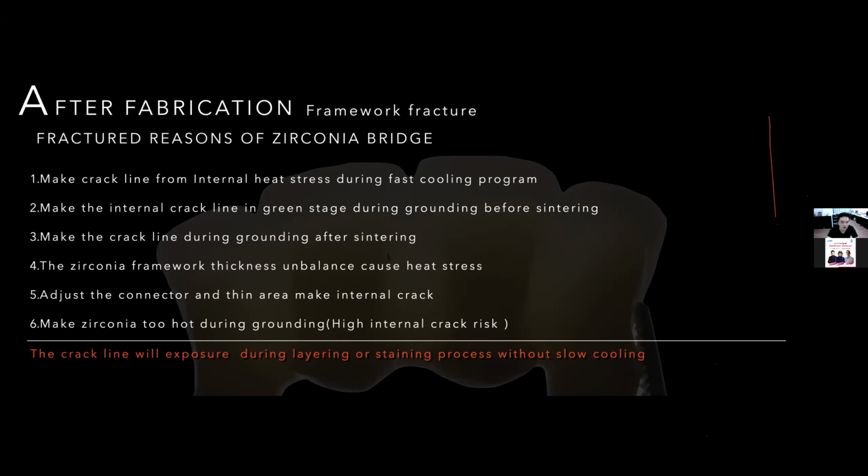Especially now a lot of the restorations are monolithic. The zirconia volume is bigger than in the past, because in the past we would layer porcelain on the framework. So our zirconia framework was smaller and thinner. But nowadays we have more and more monolithic, and our zirconia volume is more and more bigger.